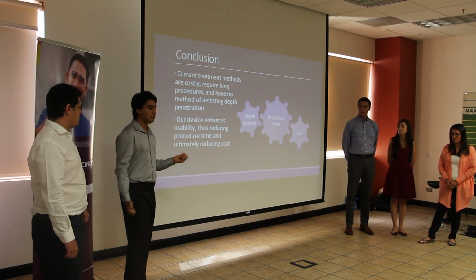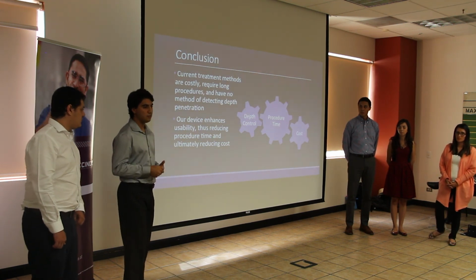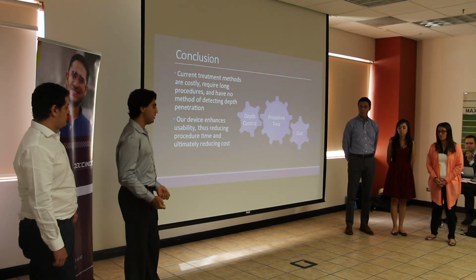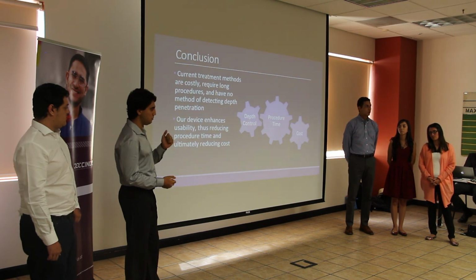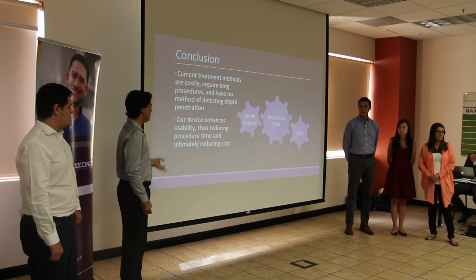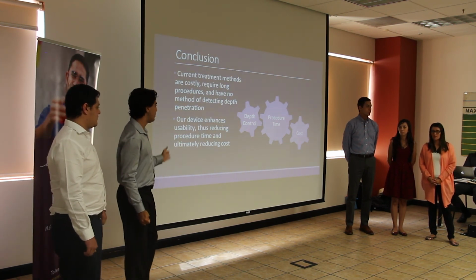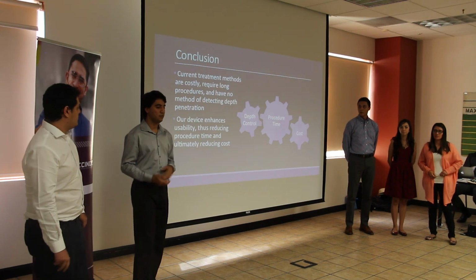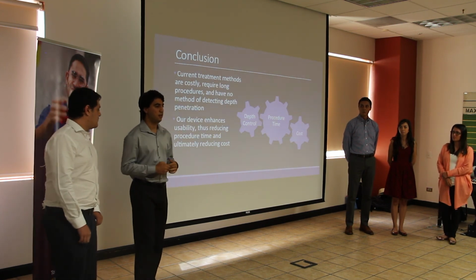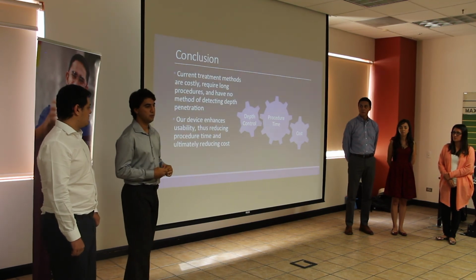By adding that alarm system, we're giving the doctor more certainty of where he is, so he can go faster and will know exactly when to stop, reducing procedure time, which would translate to money, diminishing the cost and enhancing the safety of the patient. We thank you very much for your attention.